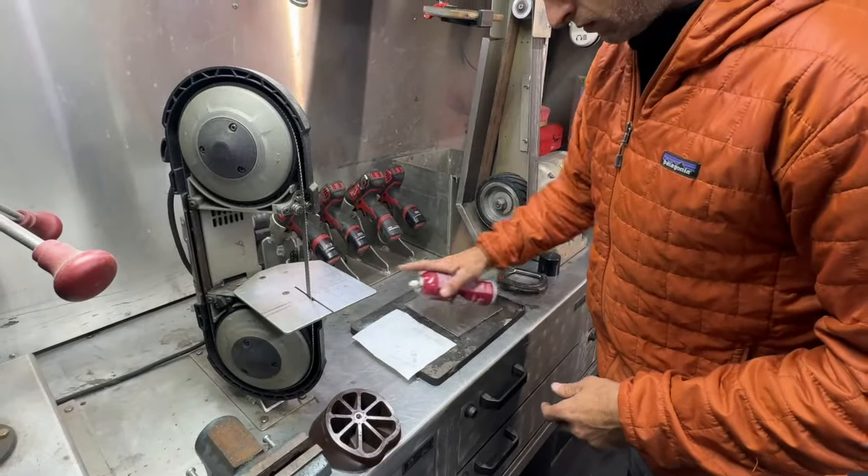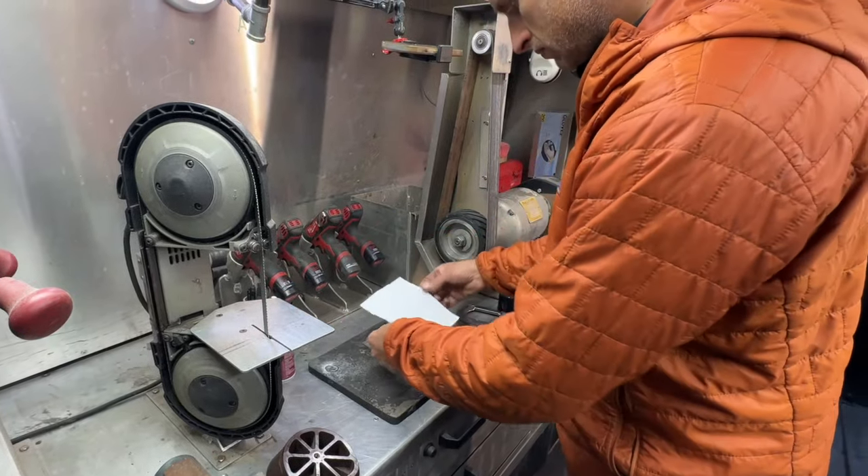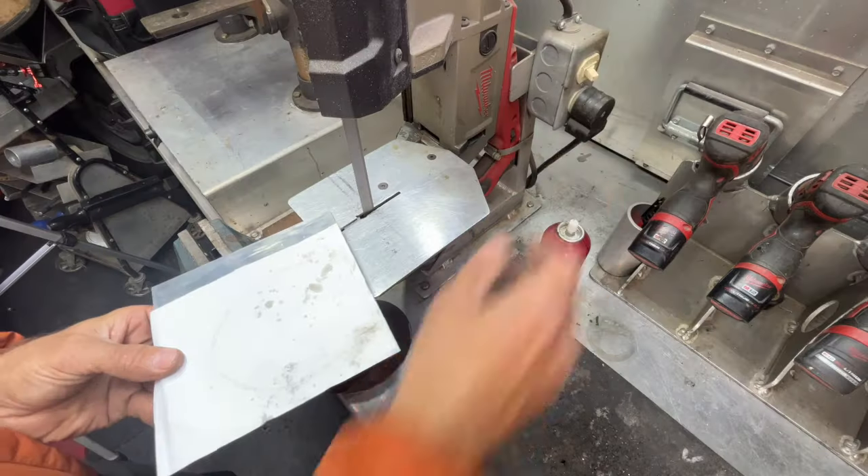Spray a small amount of 3M adhesive on the paper. This will hold the template in place against the aluminium plate. You could use some tape, but I find the adhesive works best.